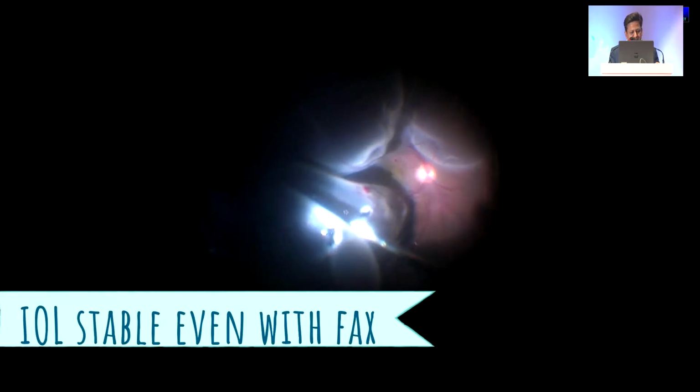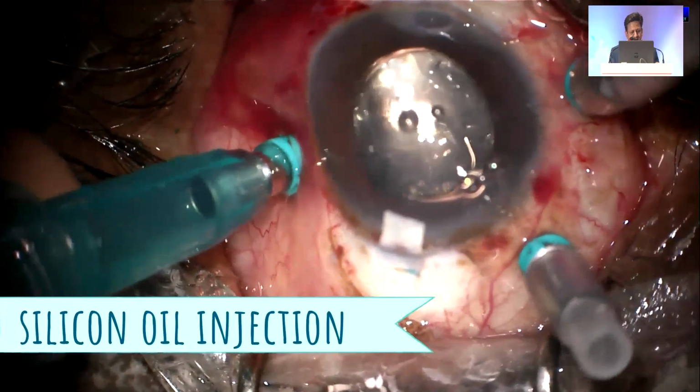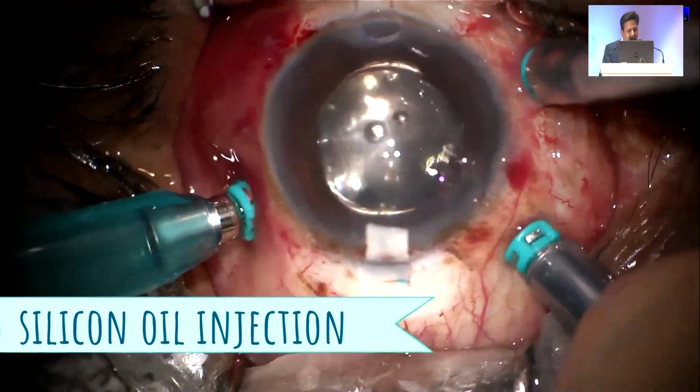Because the patient had PVR, we did primary ILM peeling also, and then we did a fluid air exchange, and laser, and silicone oil is again used in this patient.